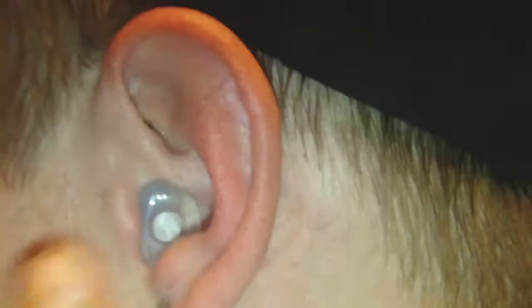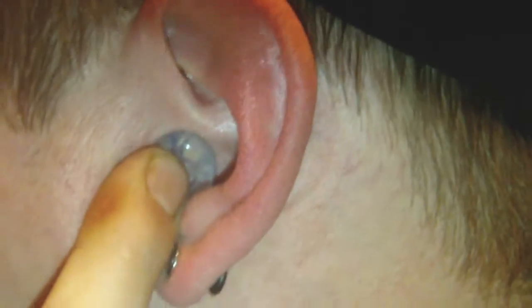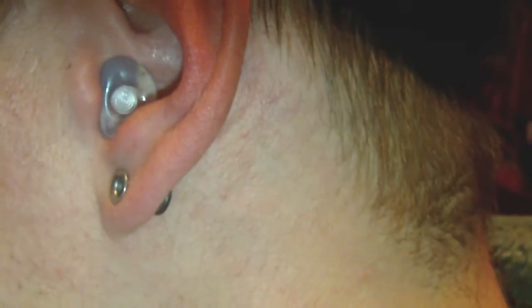You just put it in your ear and twist. There we go, like so. You can see how it sits in the ear — really small, you can't tell that I'm wearing that once it's in.